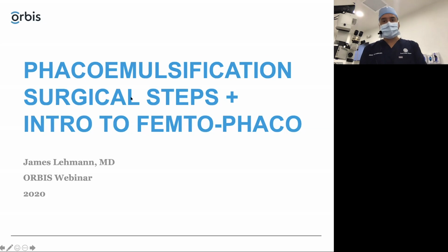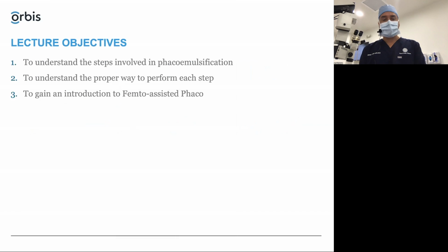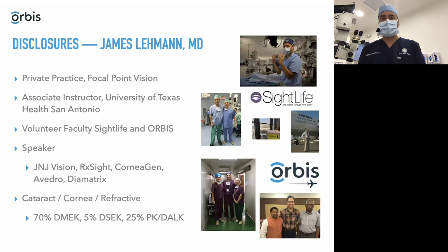So I'm going to cut over to the lecture right now, and then we'll come back to some questions at the end of the talk. So, okay, again, I'm Dr. Lehmann, and this is our phaco surgical steps and intro to Femto-phaco webinar. The objectives of this lecture are to understand the steps of phaco, to understand the proper way to perform each step, and to gain an introduction to Femto-phaco.